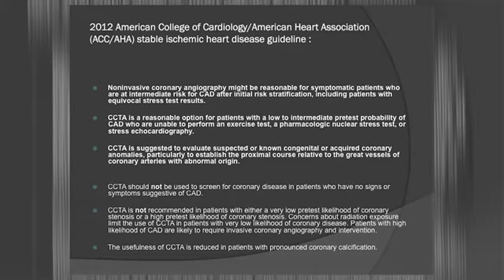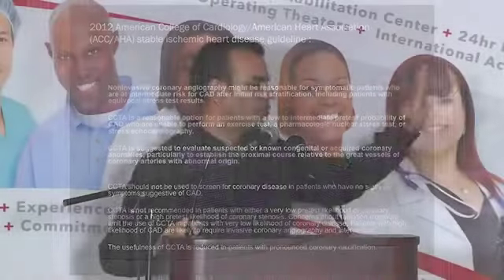So one is a group of patients who have no symptoms, no risk factors. You definitely don't want to do CCTA for them because you're giving them radiation and you know it's going to be normal. And the second group is patients who have a very high risk. You really know they have coronary artery disease. Actually, you don't want to do CCTA for them because you should do a catheter angio for them. And they can simultaneously undergo stenting, angioplasty, and surgery.